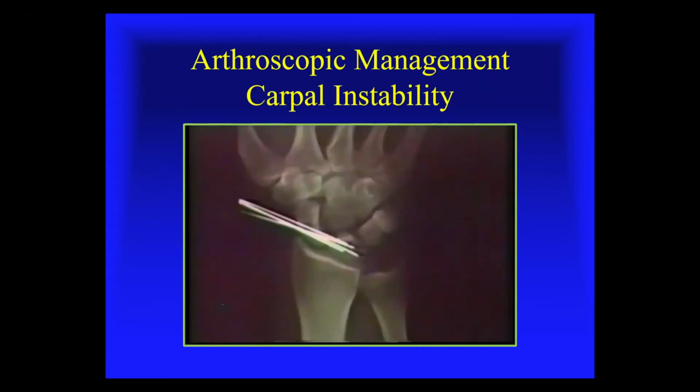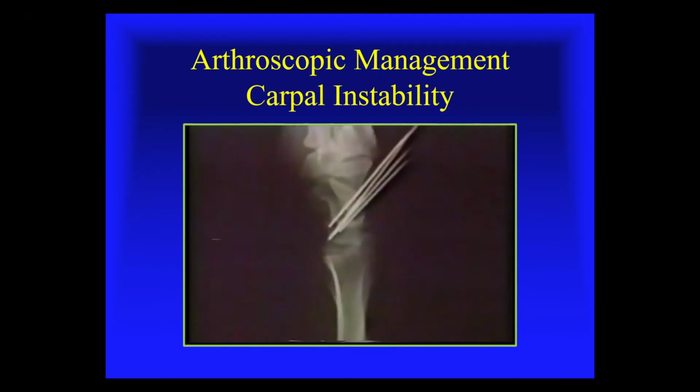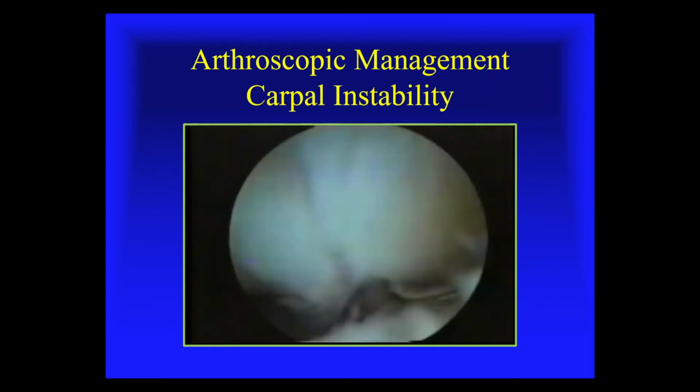We generally use 3 or 4 pins and we leave these in. Nowadays, we'll generally place a screw across percutaneously rather than percutaneous pins. But either option I think is viable.